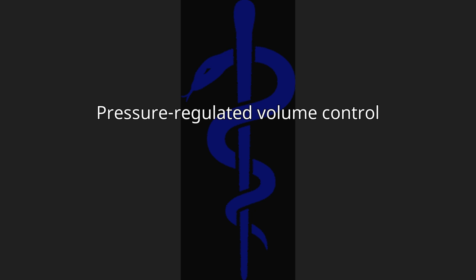Pressure-regulated volume control. Pressure-regulated volume control is an IMV-based mode. It utilizes pressure-limited, volume-targeted, time-cycled breaths that can be either ventilator or patient-initiated. The peak inspiratory pressure delivered by the ventilator is varied on a breath-to-breath basis to achieve a target tidal volume that is set by the clinician. For example, if a target tidal volume of 500 ml is set but the ventilator delivers 600 ml, the next breath will be delivered with a lower inspiratory pressure to achieve a lower tidal volume. Though PRVC is regarded as a hybrid mode because of its volume control settings and pressure-limiting pressure control settings, fundamentally PRVC is a pressure control mode with adaptive targeting.